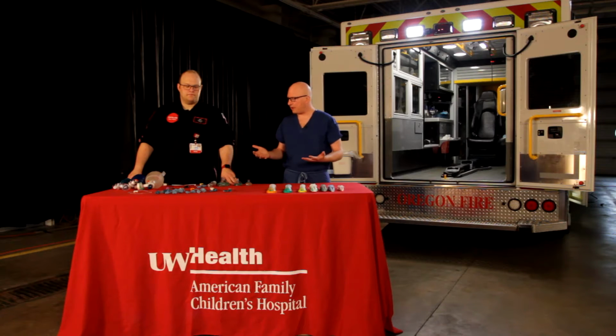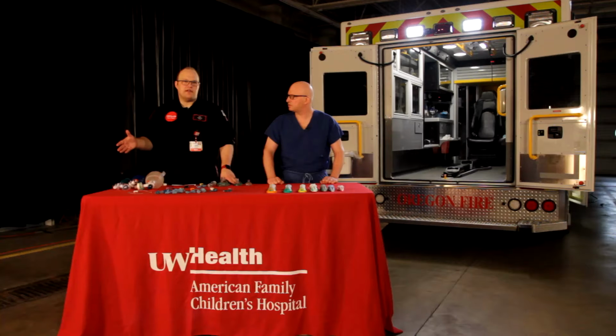Ben, let's talk about how we think about a child who's having an airway emergency or whose airway is compromised. Absolutely. So first thing you want to remember is to always go back to your basics. Before you start thinking about advanced airways, whether they be supraglottic tubes or endotracheal tubes, remember that bag mask ventilation and airway manipulation are by far going to be the most likely to succeed in decreasing that child's risk of death. So before you get into the second, third, fourth steps, make sure you know how to do the basics and do them extremely well.